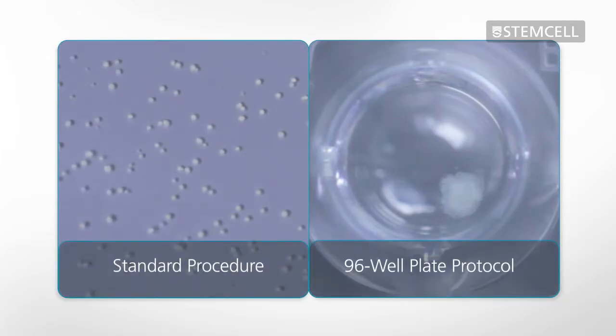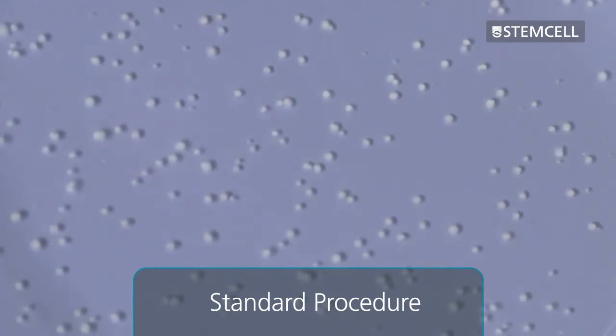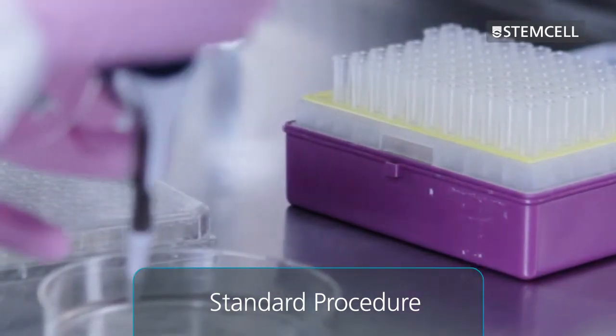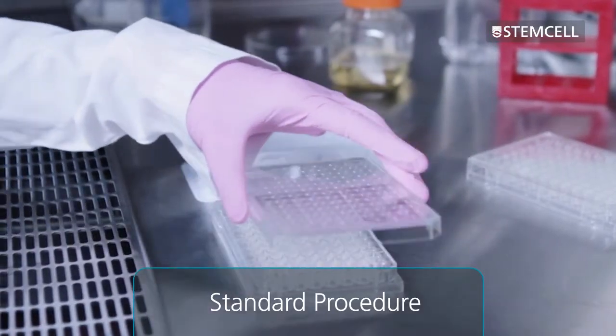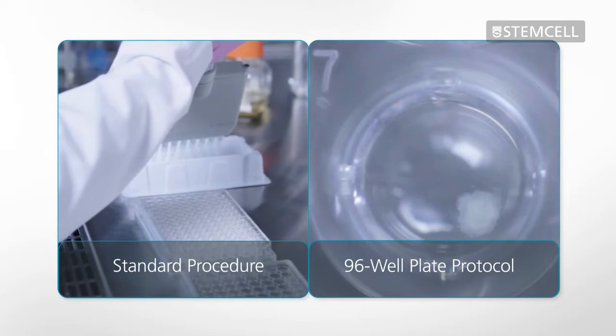There are two different methods for semi-solid cloning of mammalian cell lines. In the standard procedure, cells are suspended in selective semi-solid medium, and then plated and incubated in 10 cm plates. After incubation, colonies are picked and transferred to individual wells of a 96-well plate and expanded in liquid medium. The expanded cultures are then screened for the product of interest.